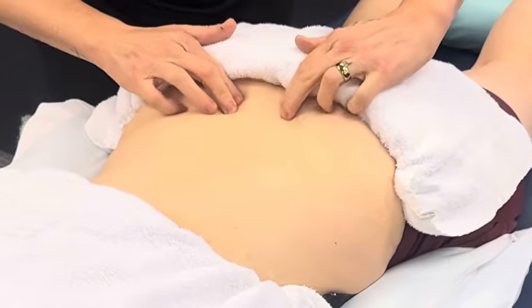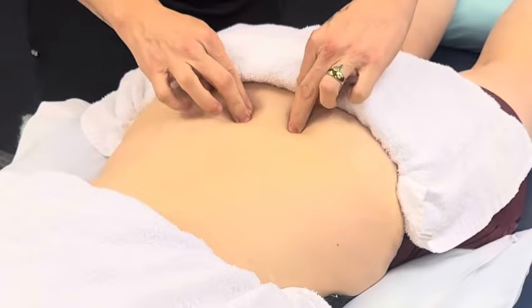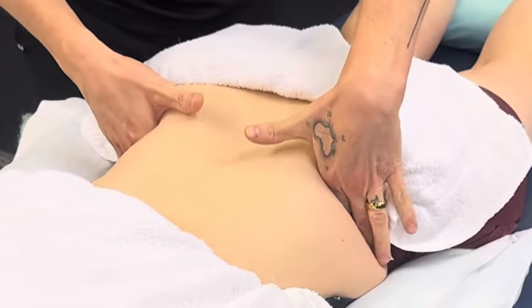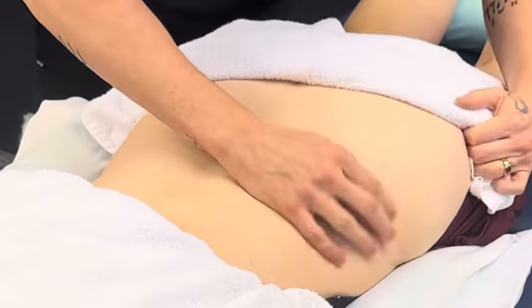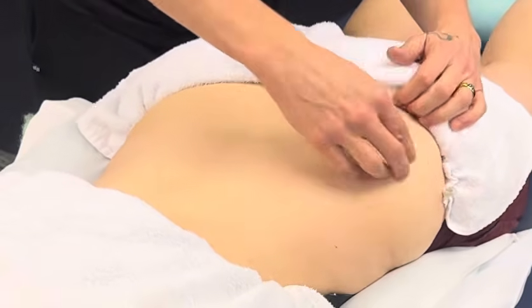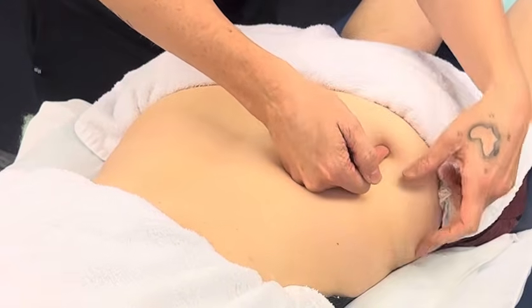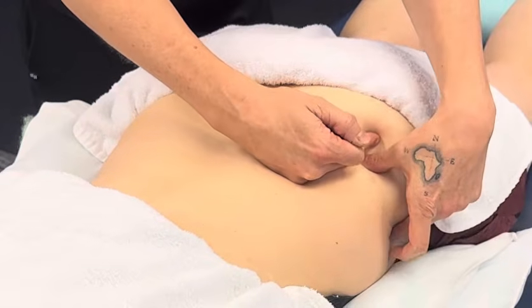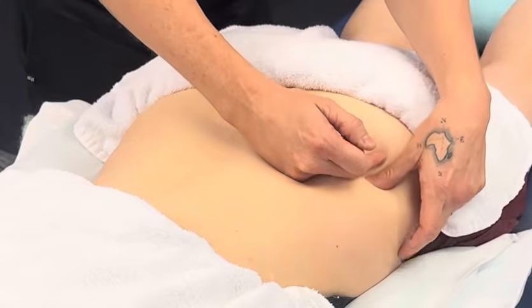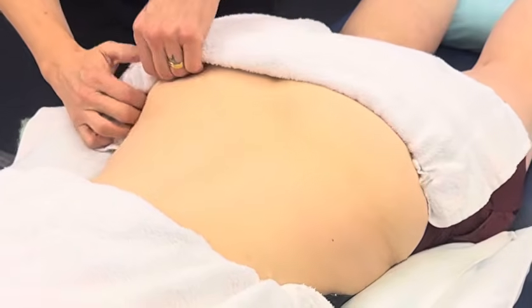To be able to get where the PSIS is. I want to be able to get SI ligaments. And if here's the top of the pelvis, I'd like to be able to get a little bit along this ridge. Oh, she feels that. Glute max till about here, and then more on the vertical glute medius. Okay. Glute max does not go all the way.